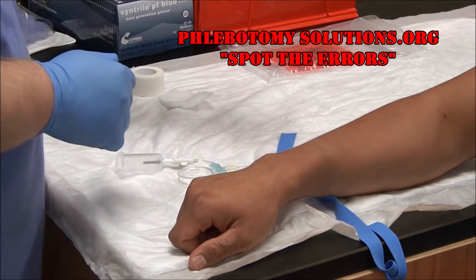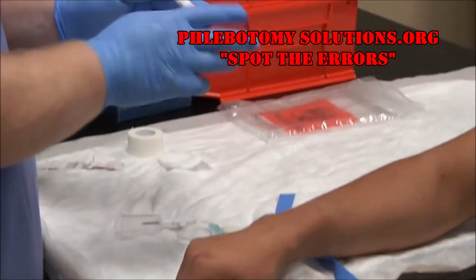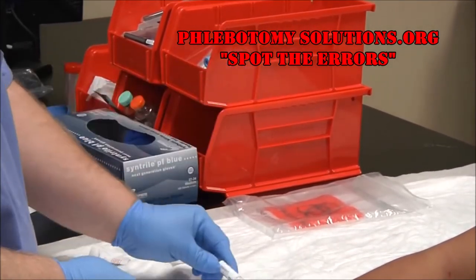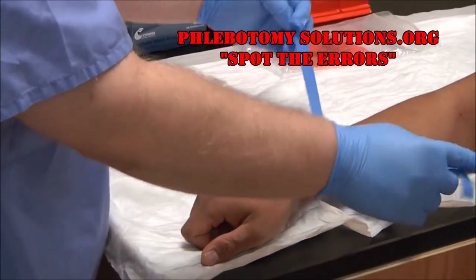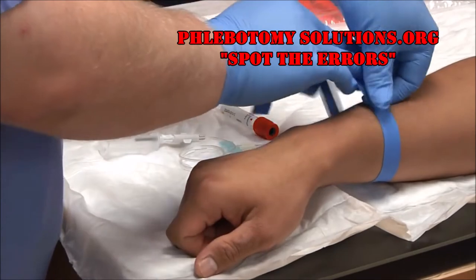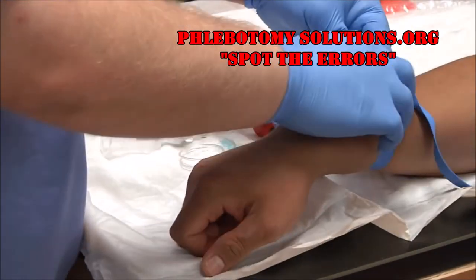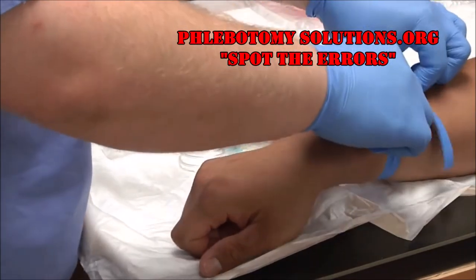Have your tubes ready. The doctor ordered one serum tube — make sure it is in date. This tube is good until December 2013 and it's currently July, so we have about five months left. Go ahead and reapply your tourniquet. When you reapply the tourniquet, this will be the very last thing you do before the draw, since you only have 60 seconds.